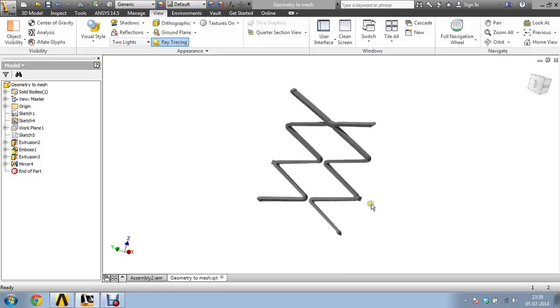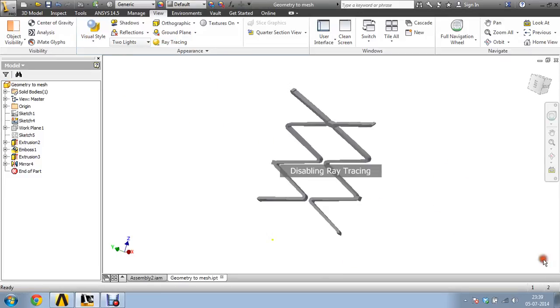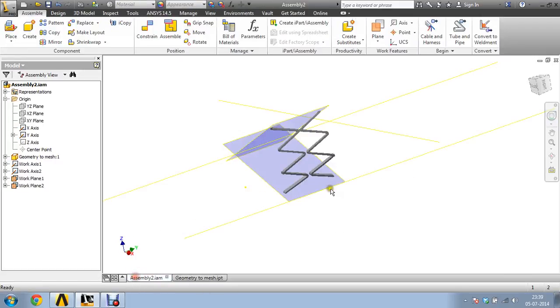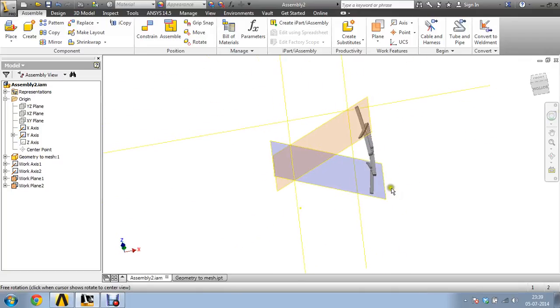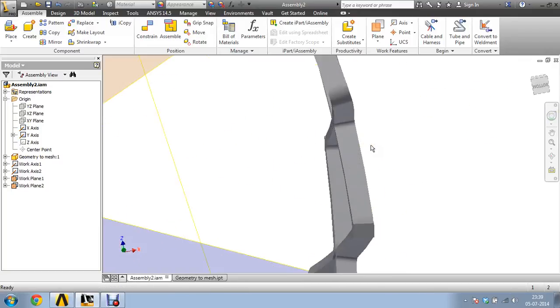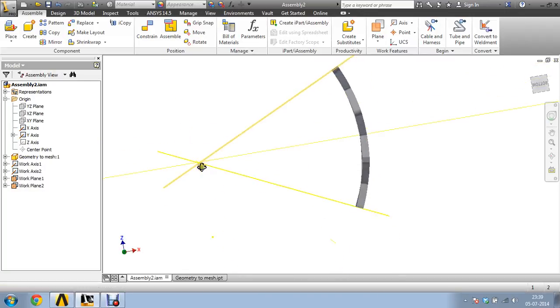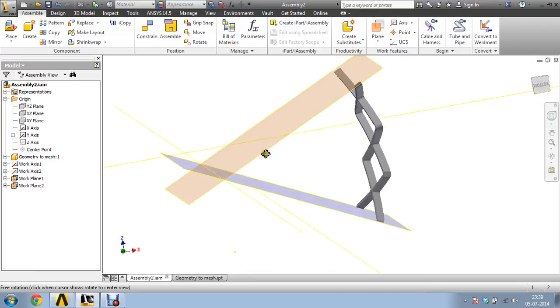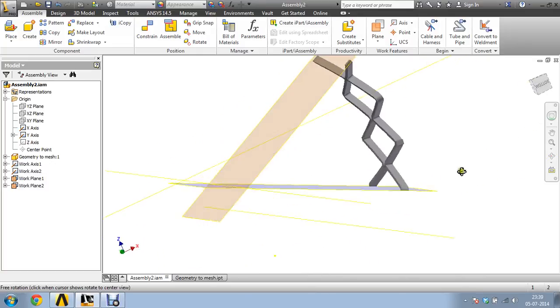So the whole stent would be around, the axis would be passing through it, and we'll see how the whole stent looks. So see here, this is an axisymmetric model of a stent, and you can see that this plane and this plane pass through the center, and this is the center line. Now in this video we'll demonstrate how we can do an FE analysis on it, and validation will be performed in subsequent videos.